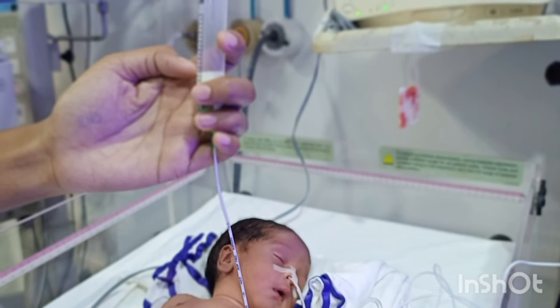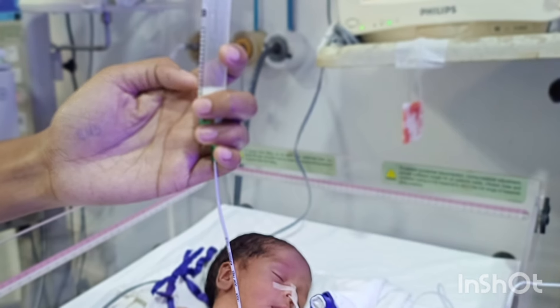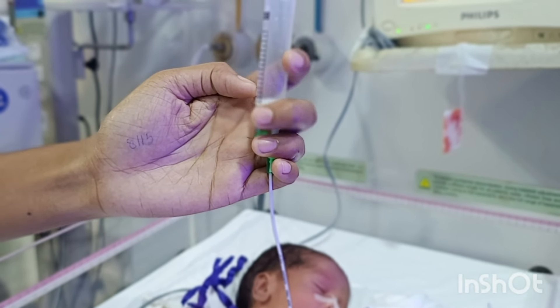Here you can see the milk is gradually going down the tube under the action of gravity, and the baby is quite comfortable. The baby is sleeping while the milk gradually goes inside.